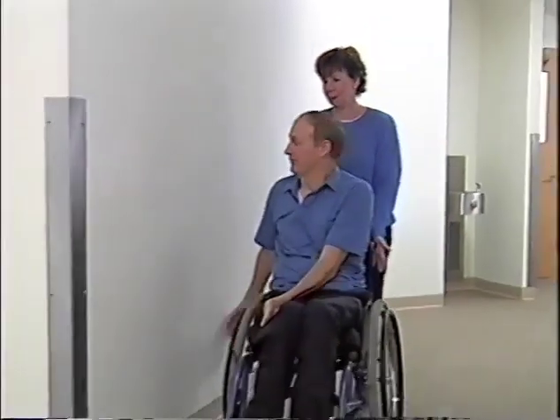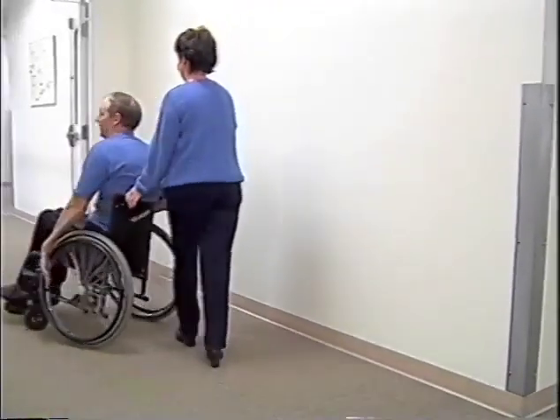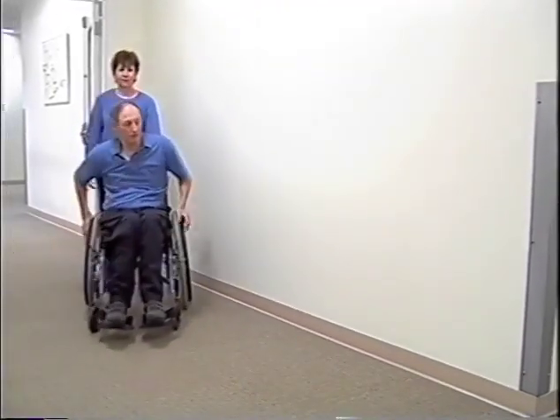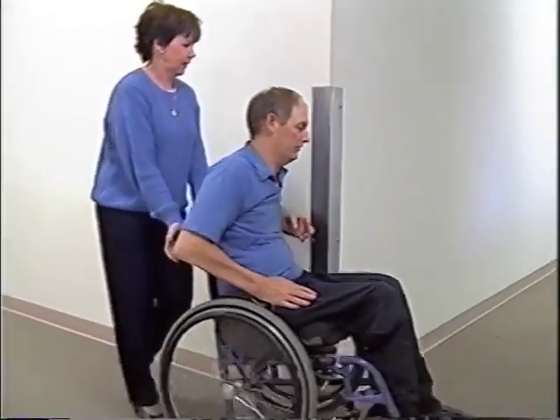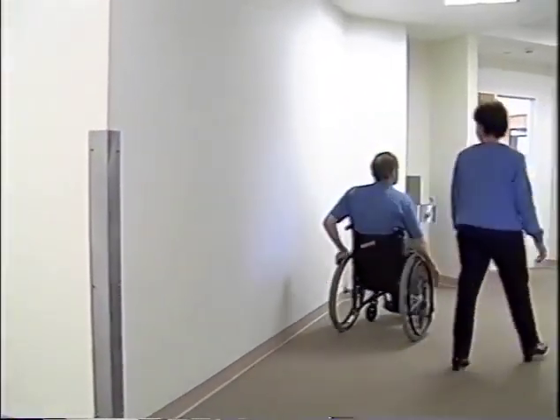For some quadriplegics just starting out, wheeling can be quite a challenge. If that's the case and you're trying to practice cornering, the therapist can simply provide the power for the wheeling, and the patient can work on just the cornering techniques. Ooh, beauty. Okay. And you can do it left-handed, right-handed. It also makes for a good opportunity for the therapist to let them see how it should feel.